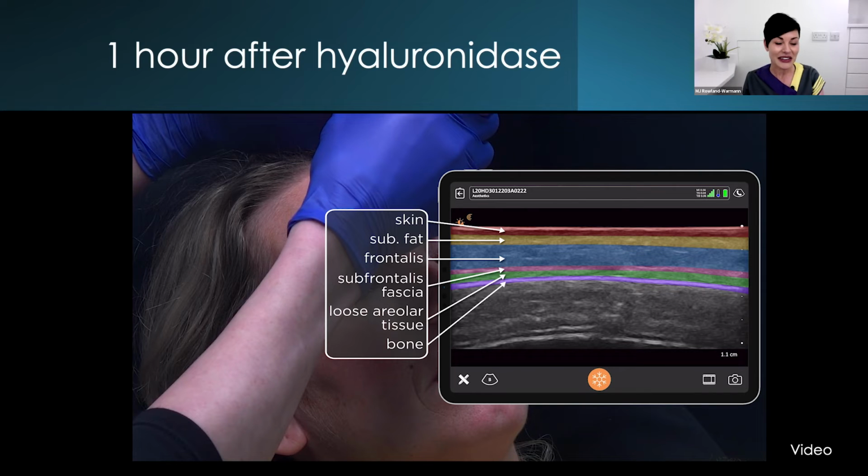Her complication is resolved. So what impact do you think this will have had on the patient? This procedure for the patient is seriously impressive. When you are properly trained and you can use your Clarius with ease, this kind of thing is revolutionary. She will go home happy, and I guarantee you she'll be a patient for life. What's more, she will refer all of her friends.